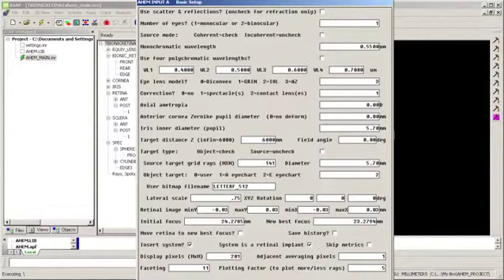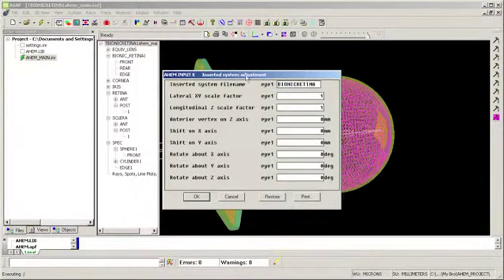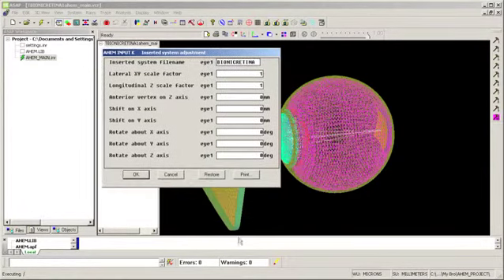I increased my faceting a bit so I could see the curvature a little better, and I click OK. And here's my AZ lens settings, so I have geometry for the eye set up for the AZ model. Click OK. And here is some information that's asked for, particular to the inserted system. So here I've got a file name for a Bionic Retina, so I can create that file either in ASAP or in some CAD application. Then I can bring it in to my system. So I can scale it in X and Y, I can stretch it in Z, I can move the vertex on the Z-axis of the anterior surface, I can shift in X and Y, and I can rotate it.